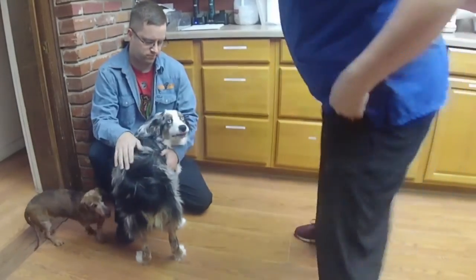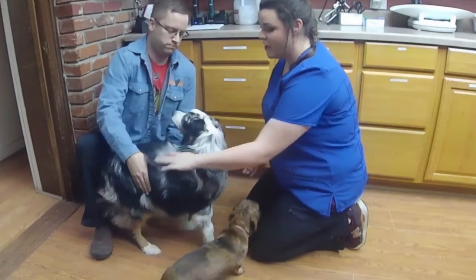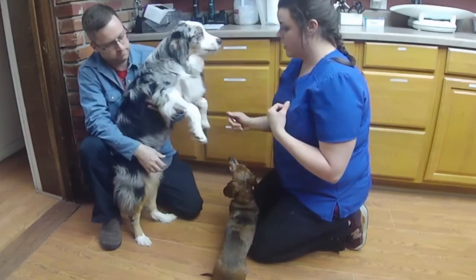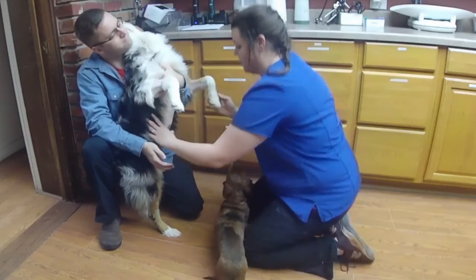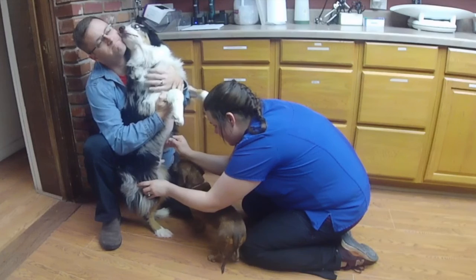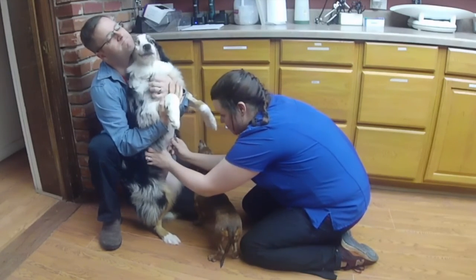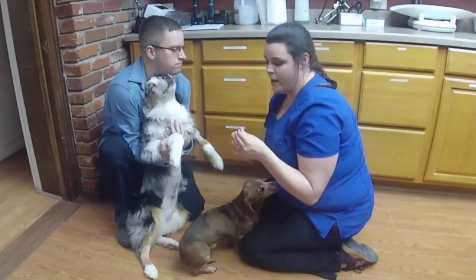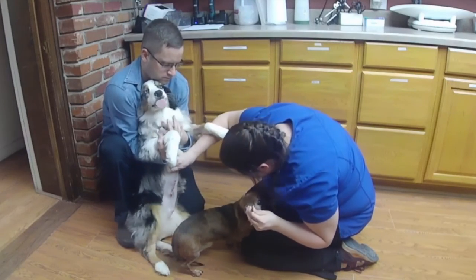And that's how to properly remove a suture or a staple. In this case, he has staples. What you want to do is hold the patient to where they will not wiggle around a lot. And you will go in and gently remove the staple. His incision site looks good, but I do not think it's ready to come out just yet. So we will let those stay in for a few more days.